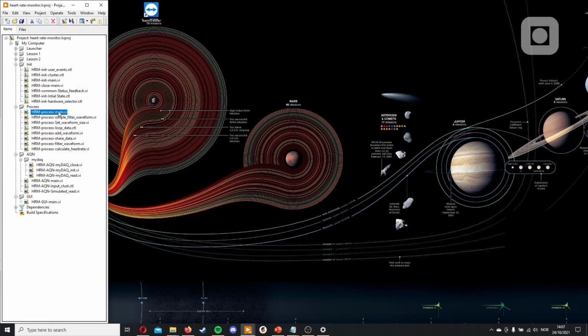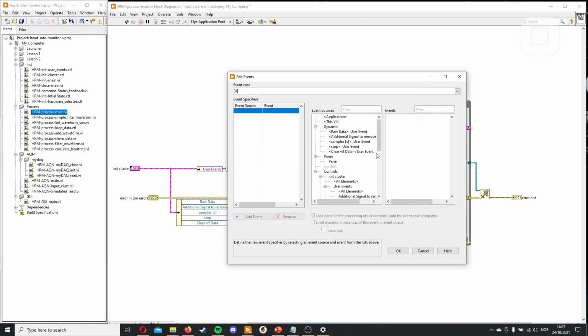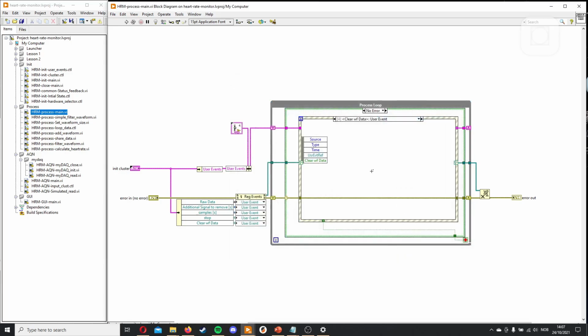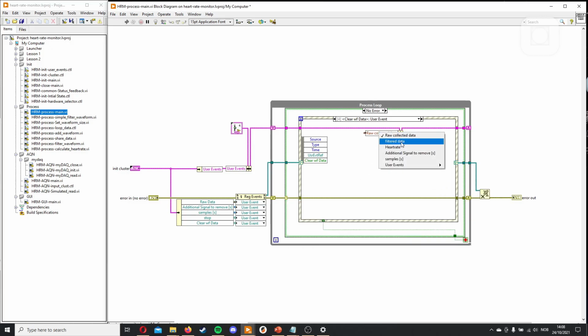We then need to go into processing to add a user event here that clears the data. Find here, clear event. And let's add it to the end here. Clear waveform data. Now, the way we have stored the data is by putting it into the raw waveform. We also have something saved into the filtered, but that's overwritten every round, while with the raw collected data, it always uses the current data and adds it. So if we set this one to empty, we will clear it.